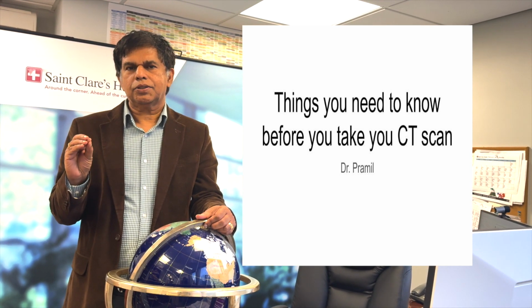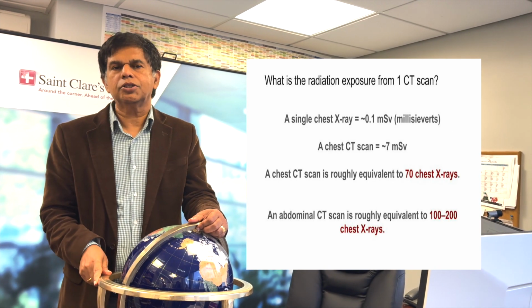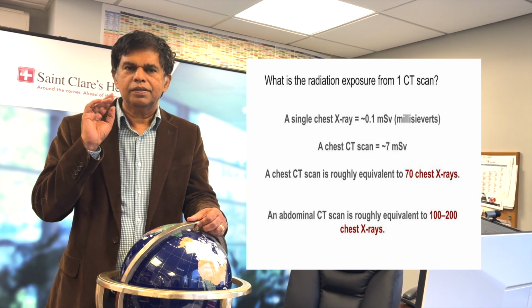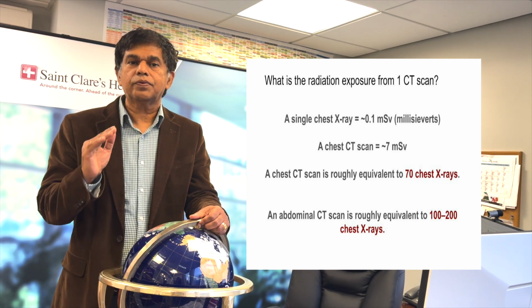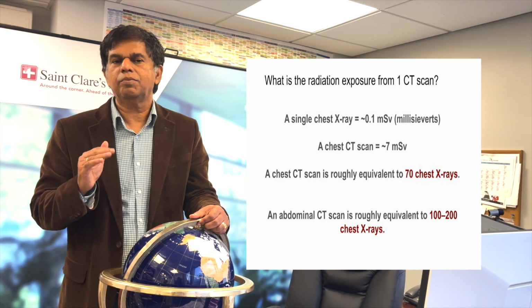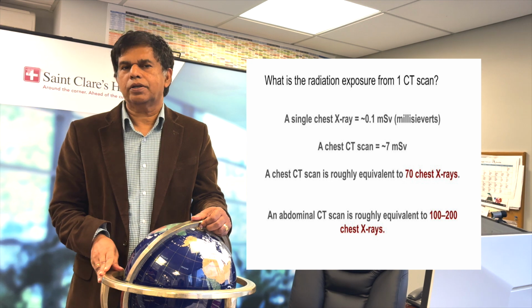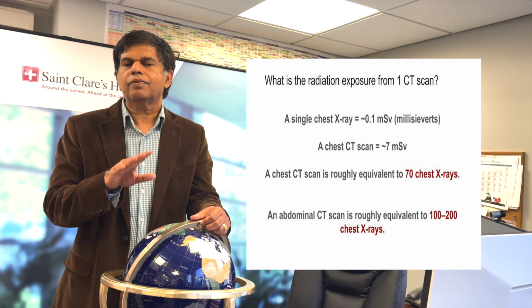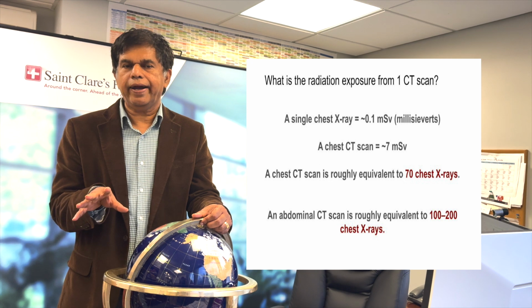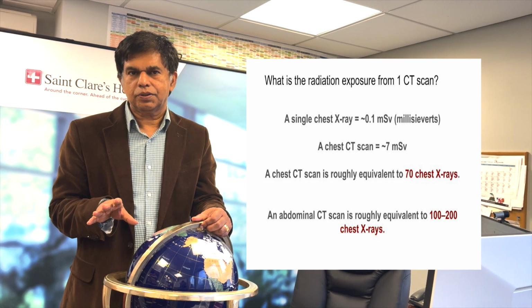Anytime you do a test, what's the first thing you should ask the doctor? Doctor, this is a test. I know radiation is involved, right? And how much radiation am I going to get when you order a test like this? Doctors are great doctors. There's nothing wrong with them. Sometimes they want a quick result so fast and they don't think about the consequences.